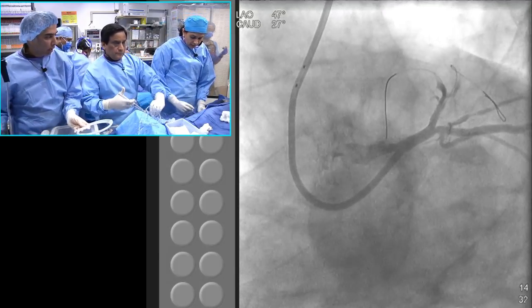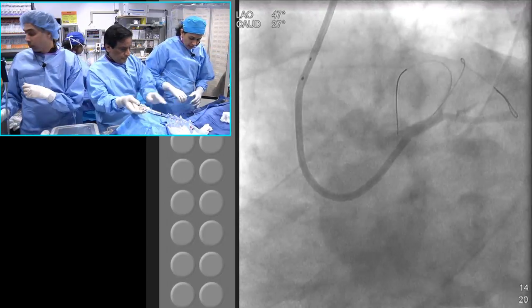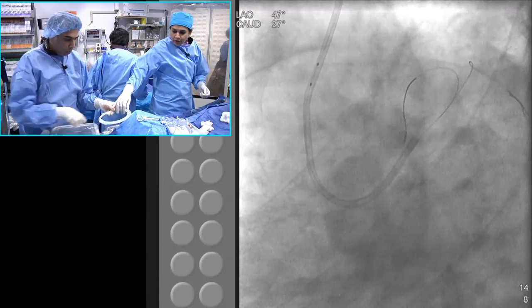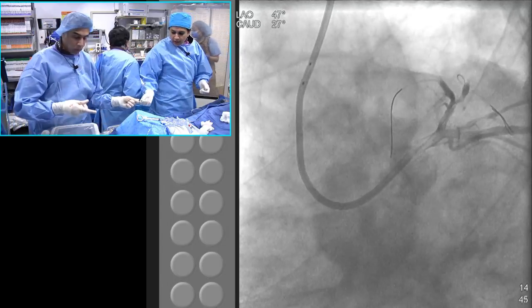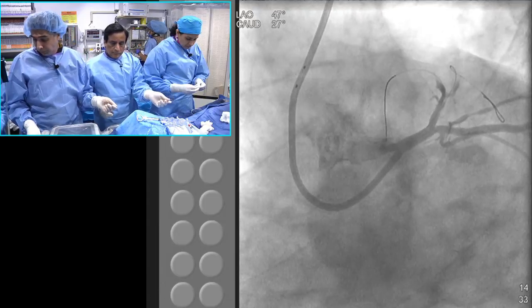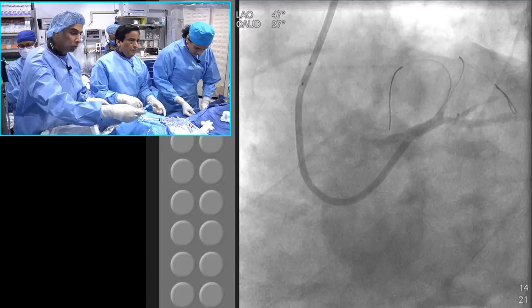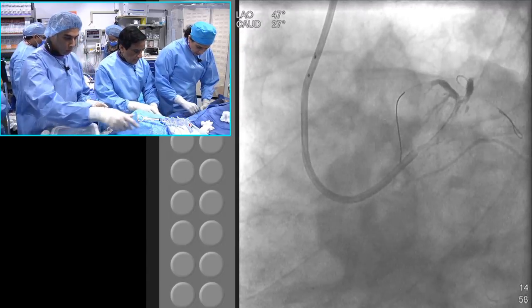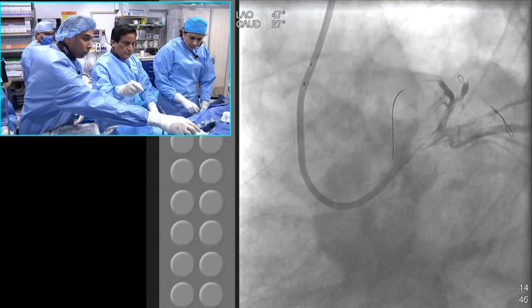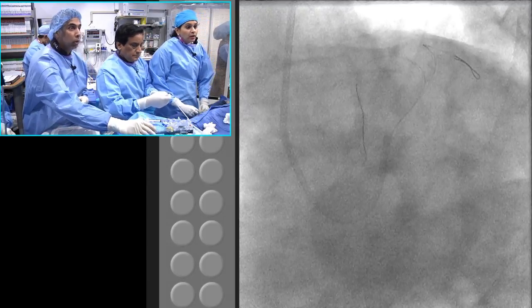Get us a stent. It's side branch. 3.0 by 12. And always the best thing is the same: go to the side branch first, since usually the side branch has some kind of an angle. So we have a 3.0 by 12 going to the side branch, and then we will have the main vessel stent placed. Part of that could be some thrombus. It could be that we were probably with the wire, noticed after the final inflation. You know, it was a reasonably tight lesion, and we had the wire there for a little while.